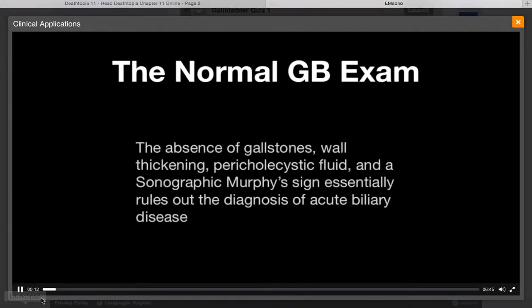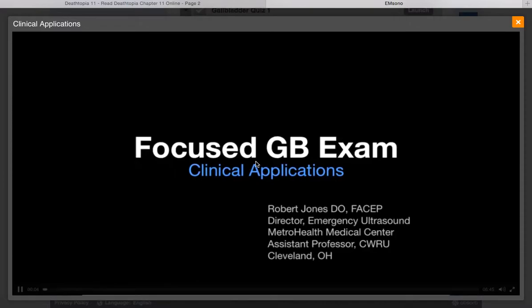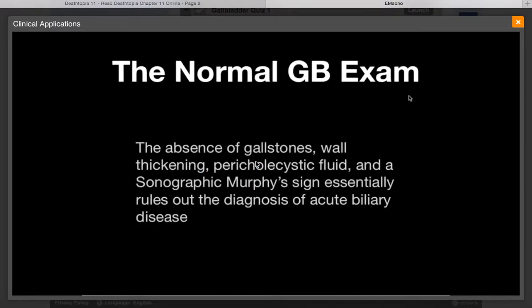Welcome to the clinical applications video in the FOCUS gallbladder exam series. So let's look at how we can use the focused gallbladder ultrasound. Let's take a look first at a normal gallbladder exam. Remember, we're not including evaluation of the intra- or extrahepatic ducts.